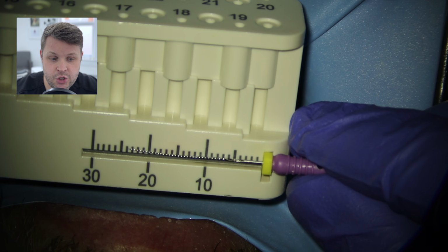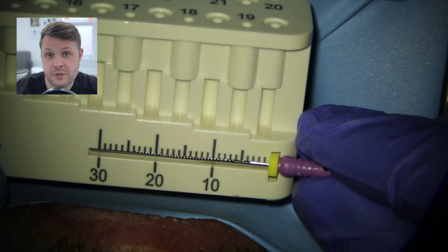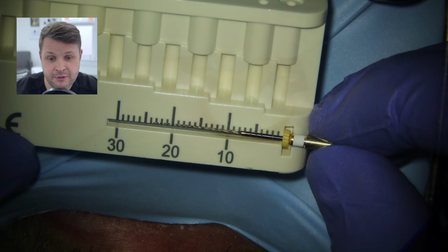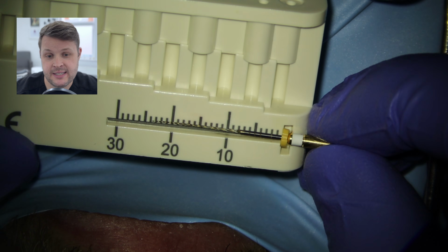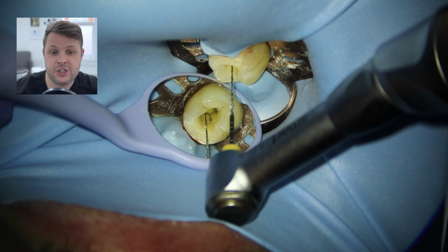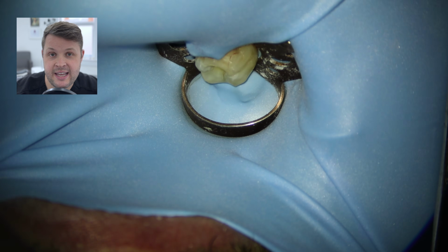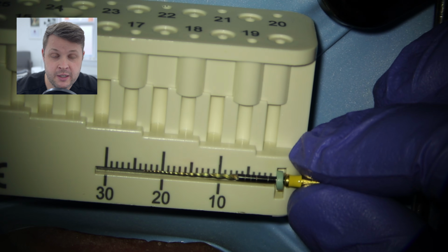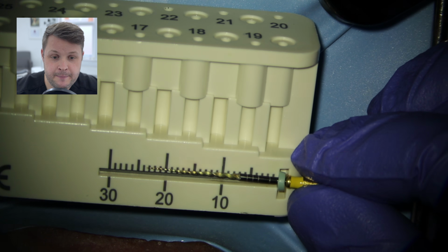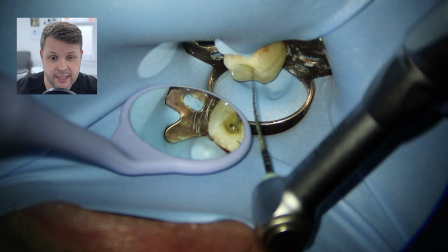So we're ready to shape this mesiolingual canal, and the first thing we're going to do is use our glide path file, the 1503, and shape this to 0. So we're going to measure this file at 24, and then shape it nicely to the 0 reading in the apex locator. We're then going to take a 2004 high flex file, and shape it minus 0.5 millimeters from the working length.